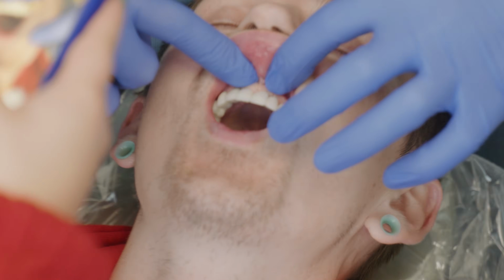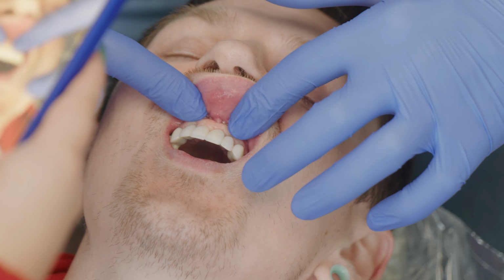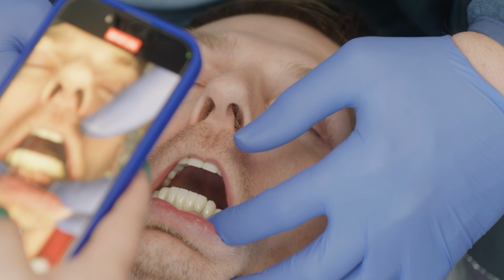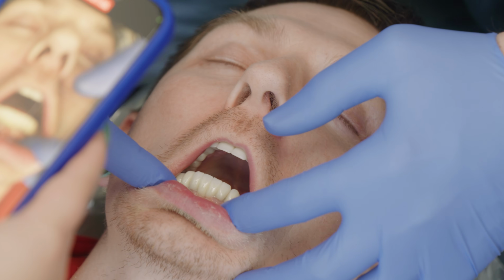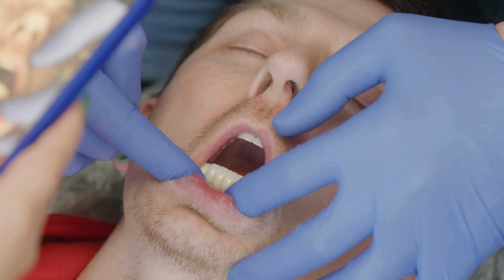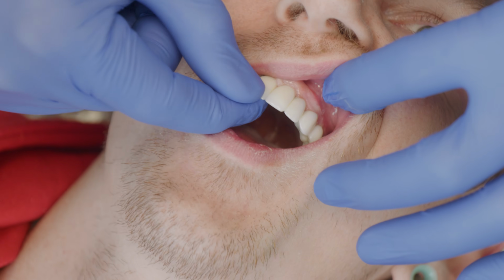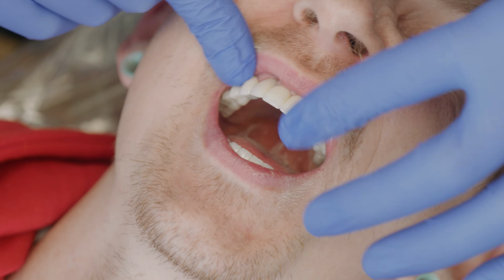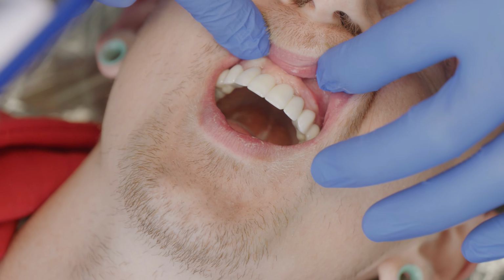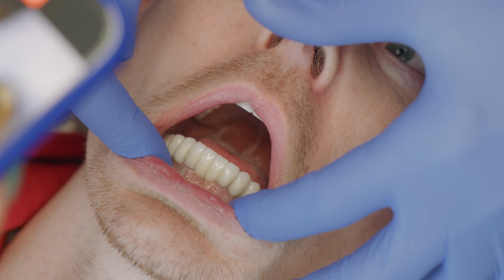You can see he still has really nice pink healthy gums around here, and they're all just right up to his teeth. Look on the bottoms, you can see it's still nice pink healthy gums and bone all up right to his teeth. So that's our goal, to try and get the gums and the bone to just maintain. Because this is broken up into 3 segmented bridges, it helps stimulate bone growth up here so that the bone can keep getting stronger and stronger and actually growing bone. And growing bone and gum tissues down here.